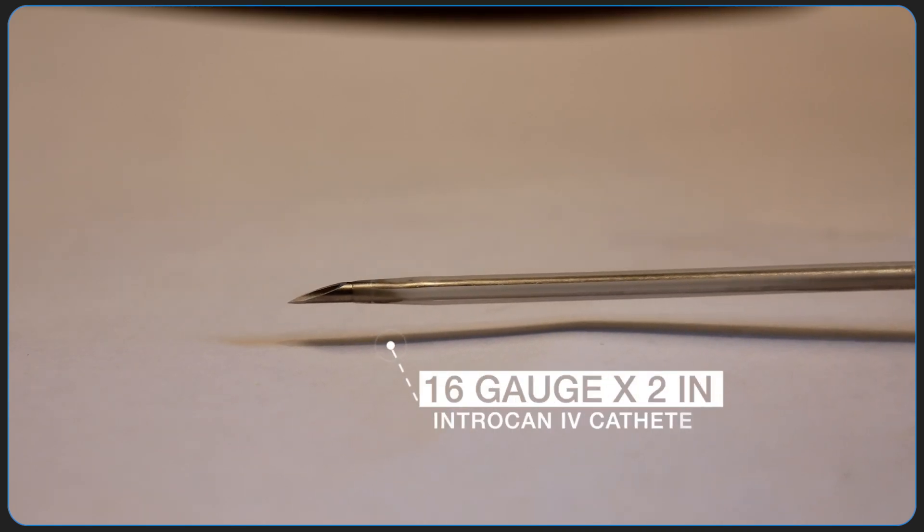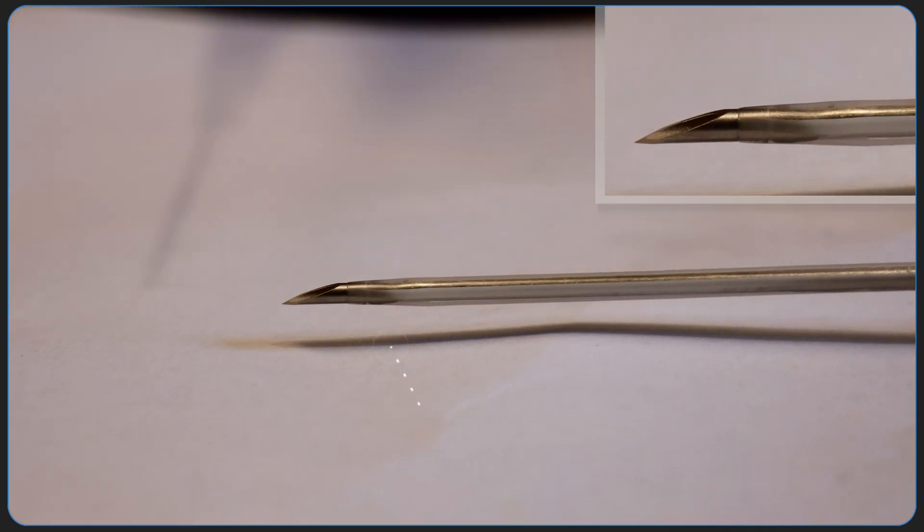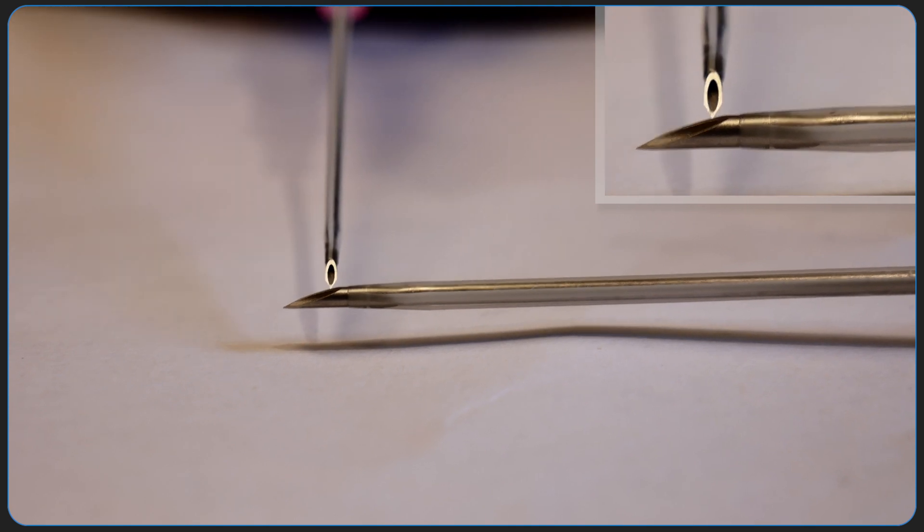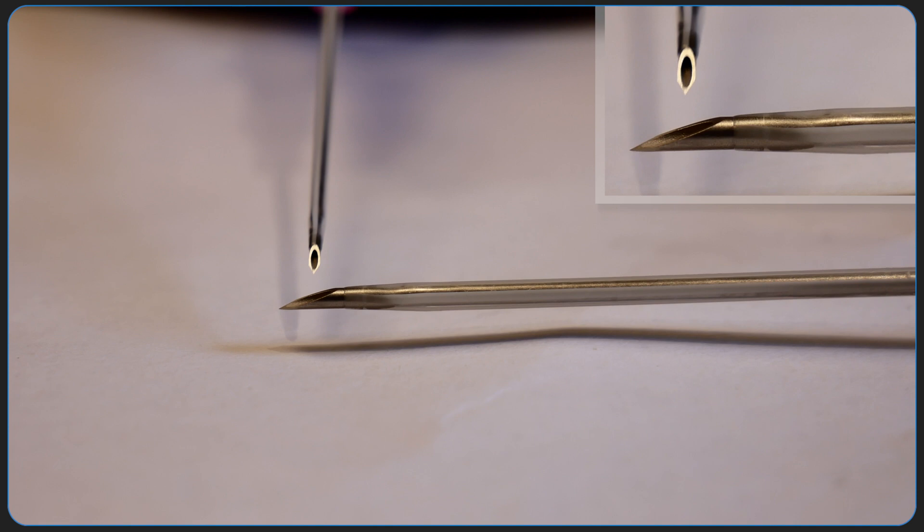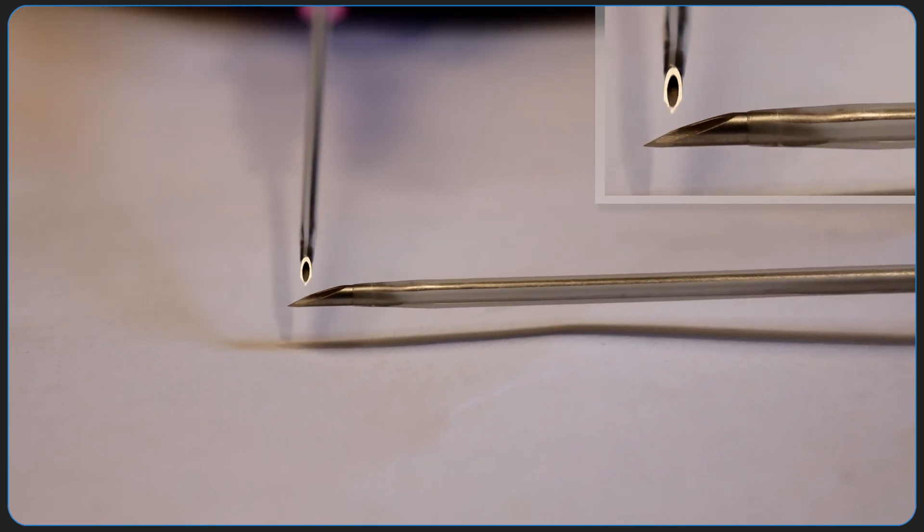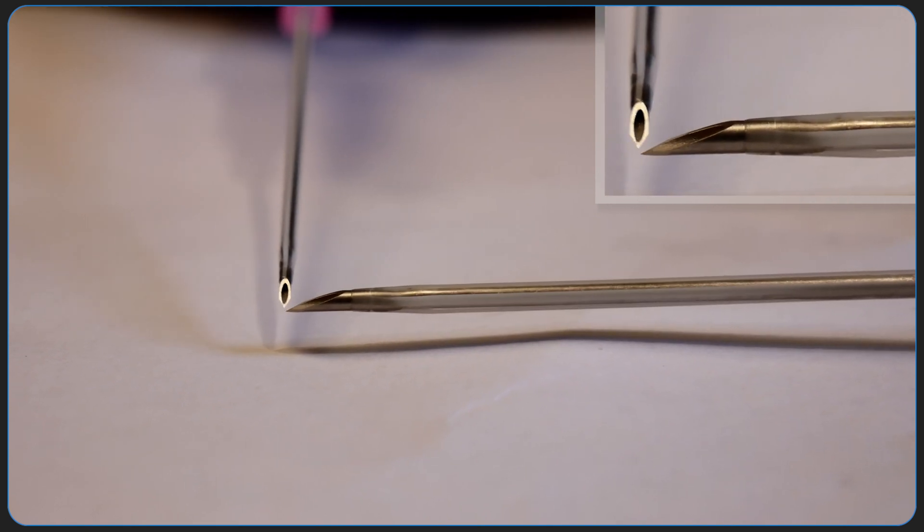So importantly, what we've been talking about applies mostly to large bore IVs. If you look at it, the bevel on this large bore IV, and I'm just pointing with the 20 gauge here, is from here to here. So that entire amount needs to find its way into the vein. If you go too little, you push off the vein with the catheter. If you go too much, but with the wrong angle, you end up going through the back wall with this tip.